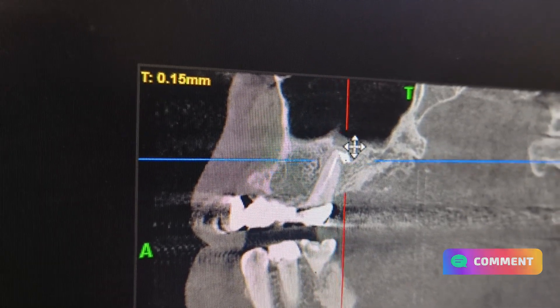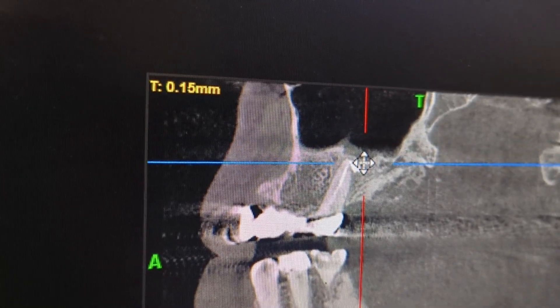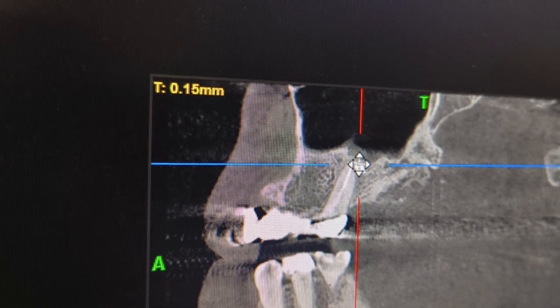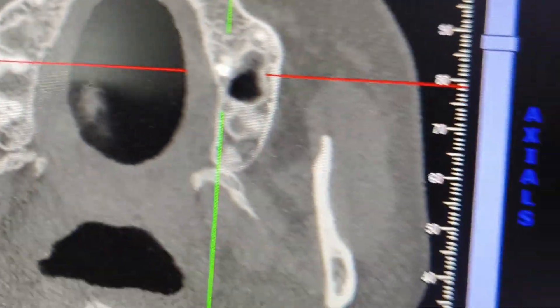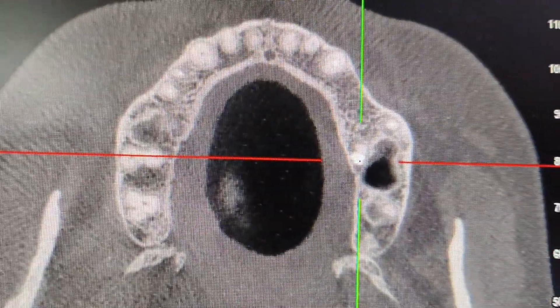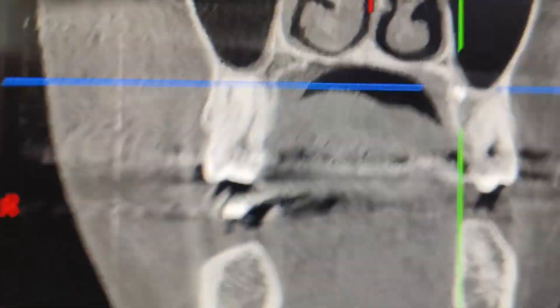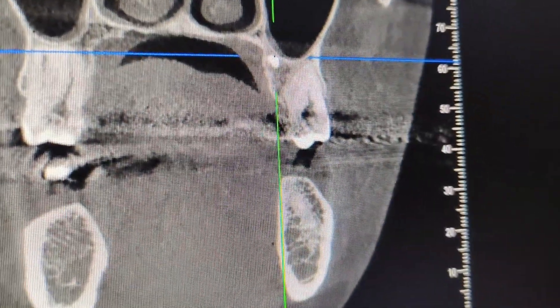You can move the cursor to different points. If you want to see a specific location, it will appear in the axial section like this, and like this in the coronal section.